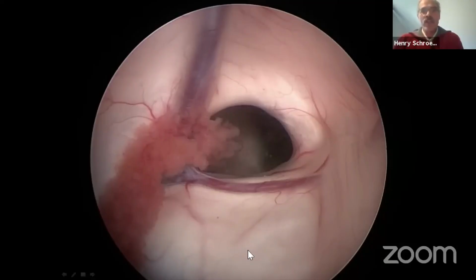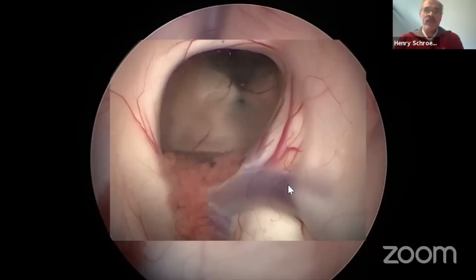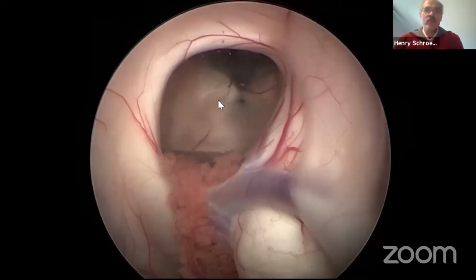Sometimes you have no thalamostriate vein, sometimes there's a very big one. You see this is a septal vein, this is a small foraminal vein. Very variable. This is a large foramen of Monro, choroid plexus running here, the fornix running here, thalamostriate vein, choroid plexus, and in the depths is the massa intermedia, and this is already mammillary bodies visible. That's the floor of the third ventricle.